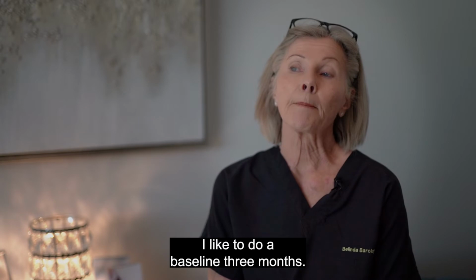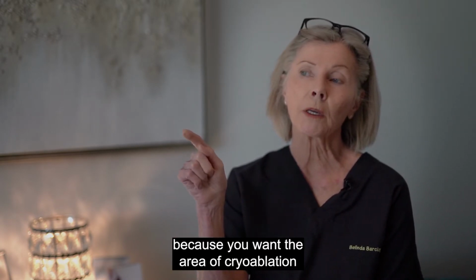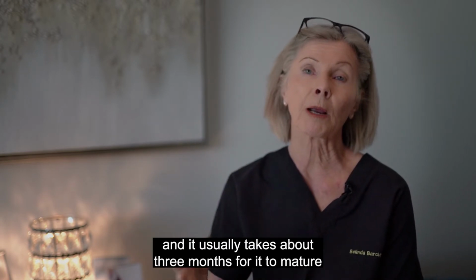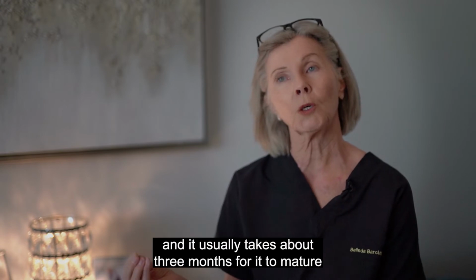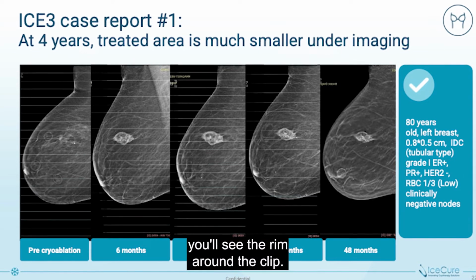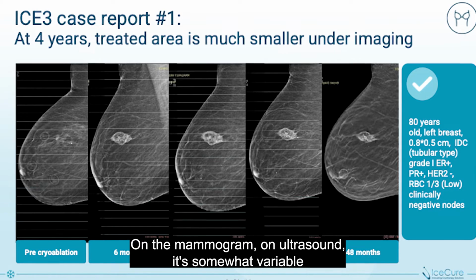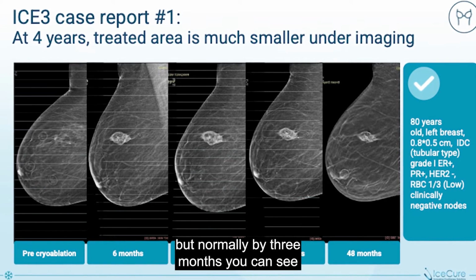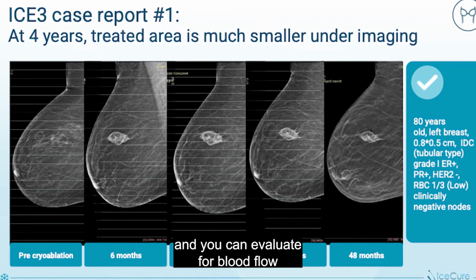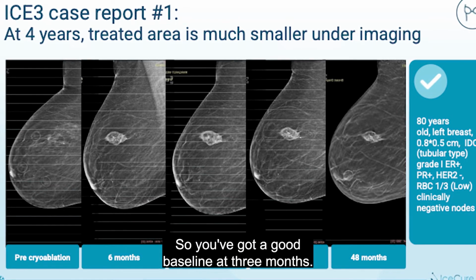I like to do a baseline at 3 months. There's no point really in imaging before that, because you want the area of cryoablation to be clearly seen on ultrasound and mammogram, and it usually takes about 3 months for it to mature so that you can actually see it. Definitely in a fatty breast, you'll see the rim around the clip on the mammogram. On ultrasound, it's somewhat variable, but normally by 3 months you can see the outline of the cryoablated area, and you can evaluate for blood flow in and around that cryoablated area. So you've got a good baseline at 3 months.